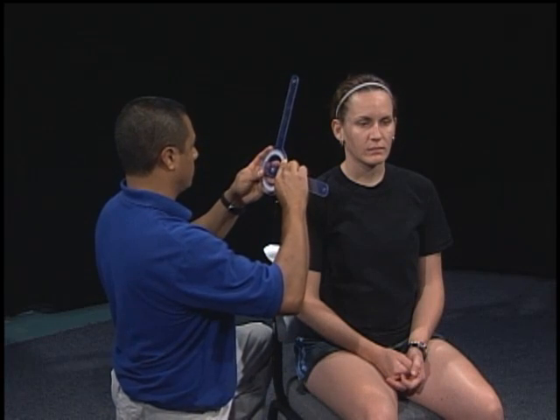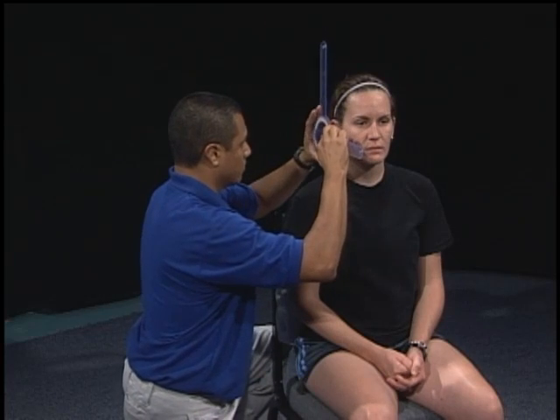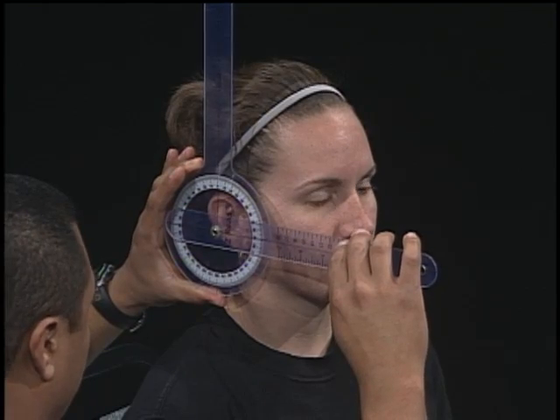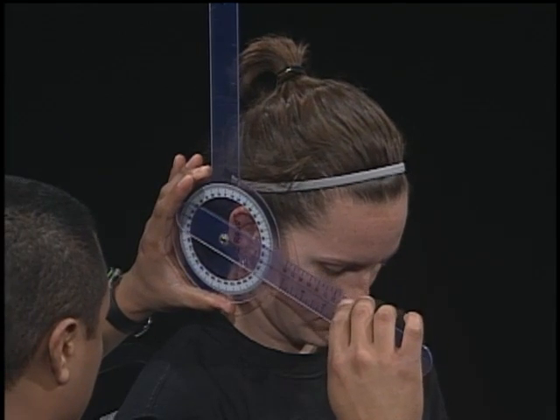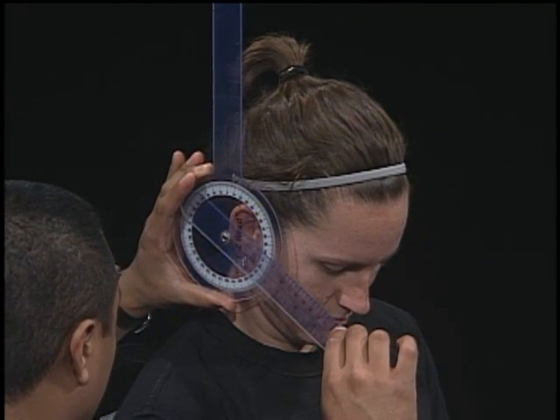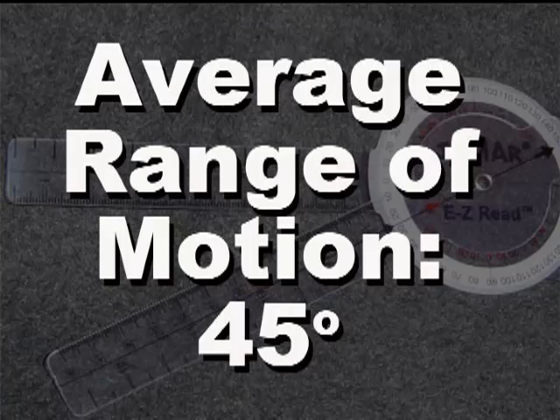Make a note of the amount of degrees measured. Measure twice. If the measurements are off by greater than 5 degrees, take a third measurement. Take the average of the measurements and document it in the patient's chart. Average range of motion according to the American Association of Orthopedic Surgeons is 45 degrees.